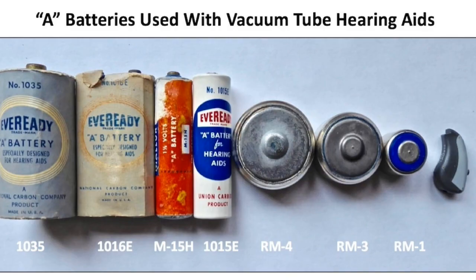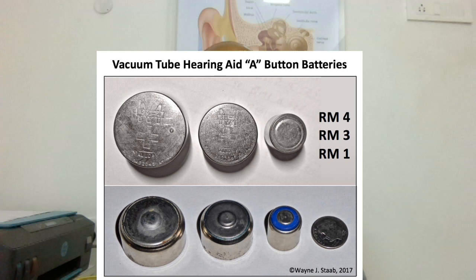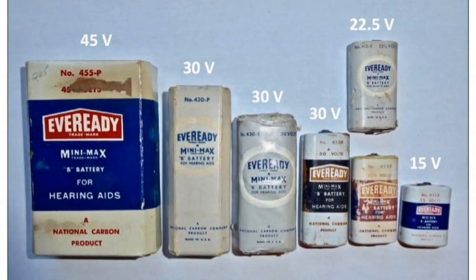Vacuum tube hearing aids had two types of batteries, type A and type B. The type A batteries were 3 volts earlier and then became 1.5 volts, and they were used to power the vacuum tube filaments. Type B batteries were used to power the plate circuit to amplify the sound, and they were as high as 90 volts. They became 45 then, 30, 22.5, and finally became 15 volts.